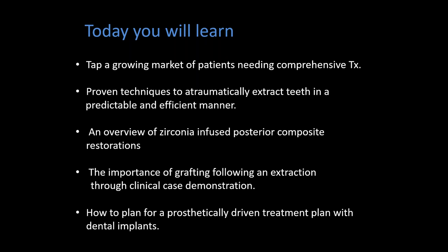Most importantly, we do want to show you the techniques and the instruments that we do use, especially what I use within my practice, to atraumatically extract teeth in a very predictable and efficient manner. We're also going to go over some restorative and one of the new and exciting materials that are out there from Wagofil is the zirconia infused posterior composites. So it's a composite restoration that's 40% filled with zirconia.